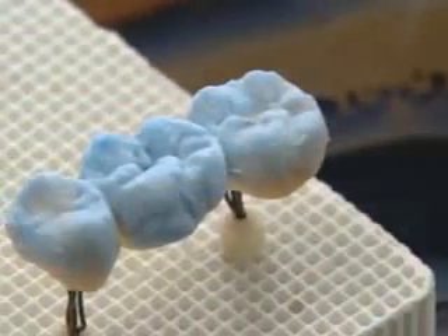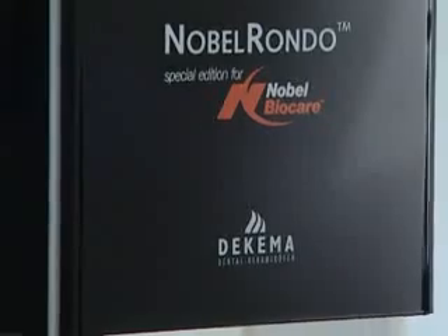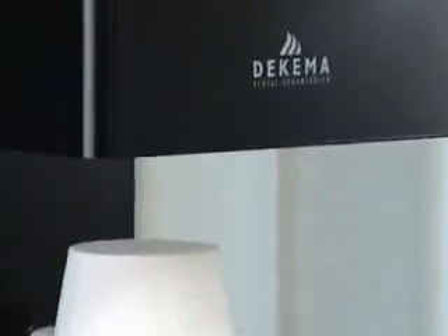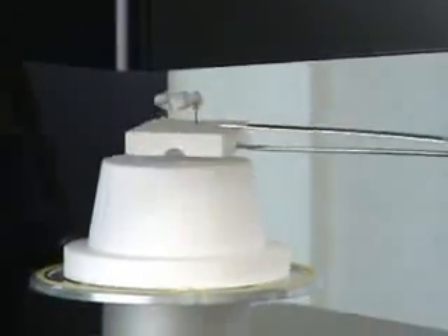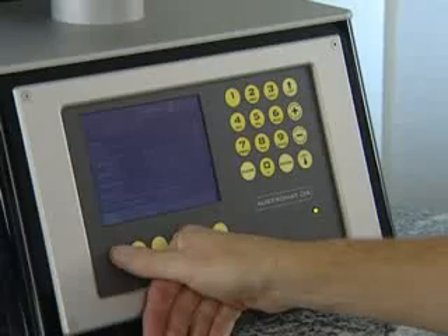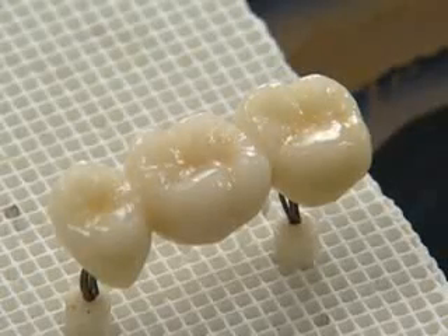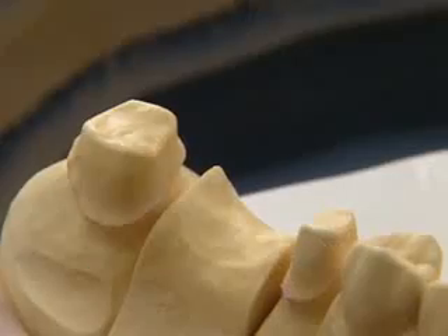The first firing at 910 to 915 degrees Celsius under a vacuum does not require any slow cooling period. The ceramic's thermal expansion coefficient is optimally adjusted for zirconia substructures. After firing, the compact homogeneous surface shows a light glaze.